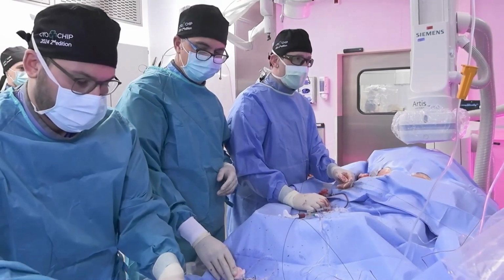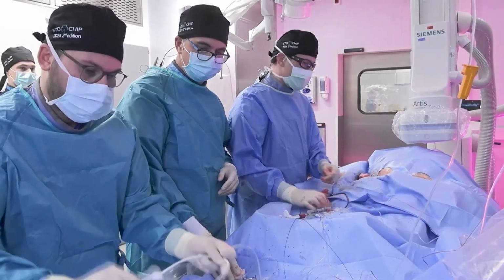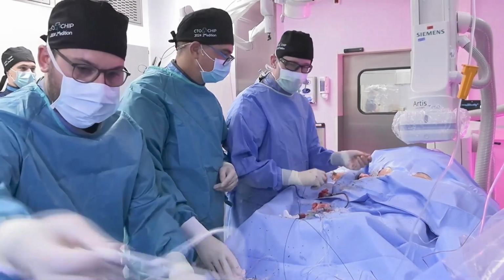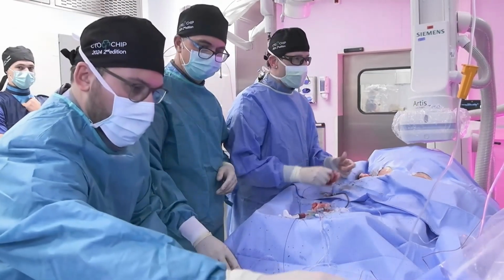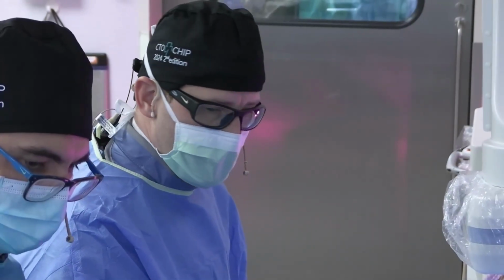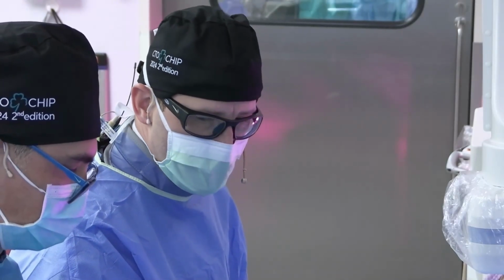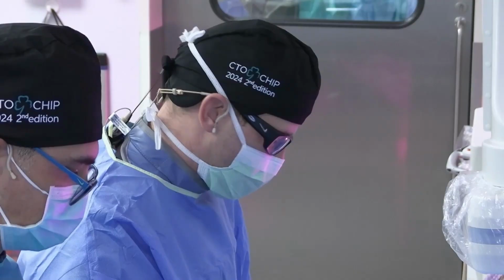We were debating whether we should do this as a protected case or not. There are some retrograde options, and there may be difficulty preserving the bifurcation or getting the bifurcation antegradely.